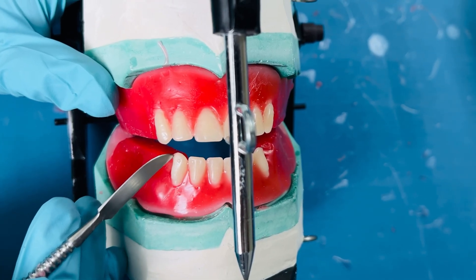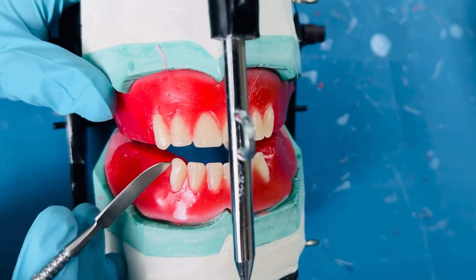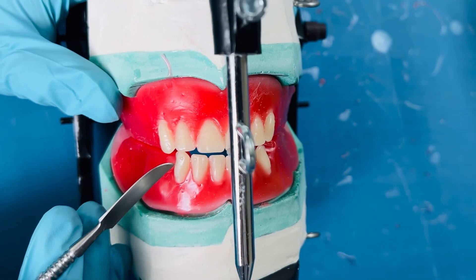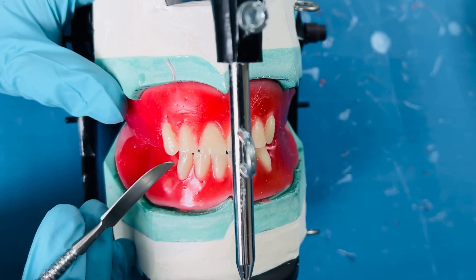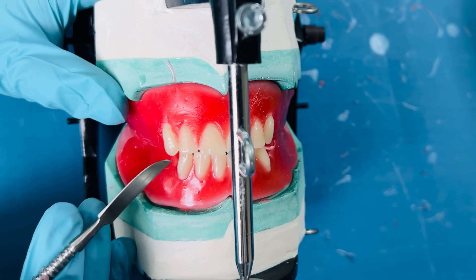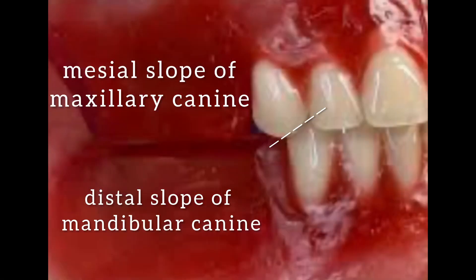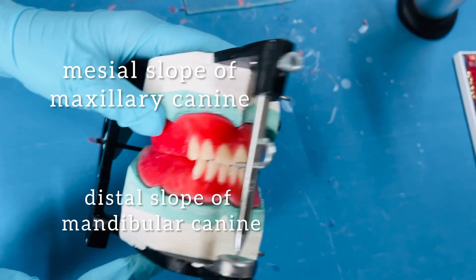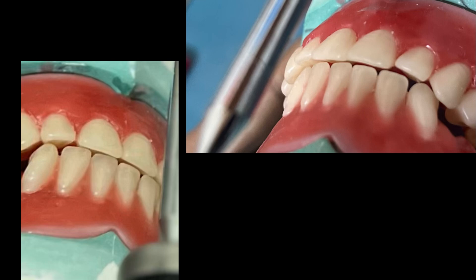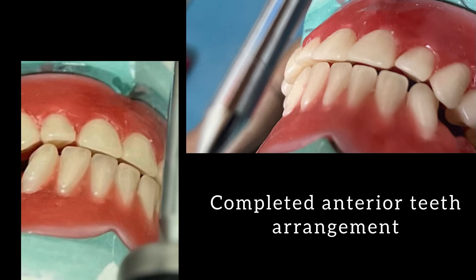The next important thing to verify and confirm is canine relation. In class 1 teeth arrangement, the mesial slope of the maxillary canine should approximate the distal slope of the mandibular canine. Seal the wax around each tooth properly and cool it. That completes the mandibular teeth arrangement. Thank you.